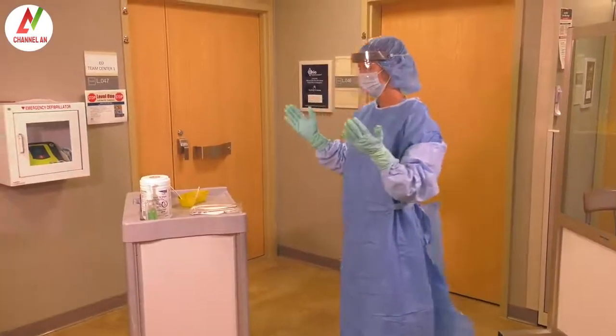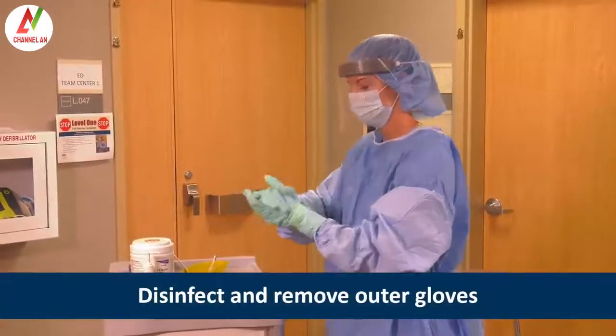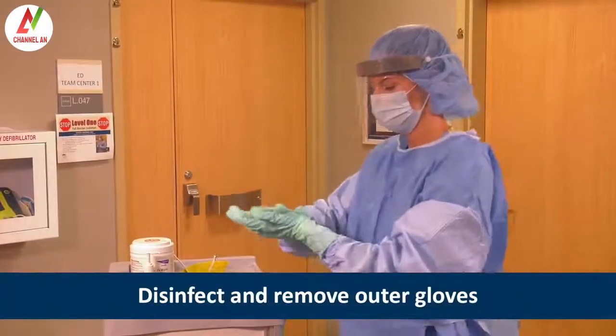Since Heather donned two pairs of extended cuff gloves, she first disinfects the outer gloves with an alcohol-based hand rub and then removes the outer gloves.